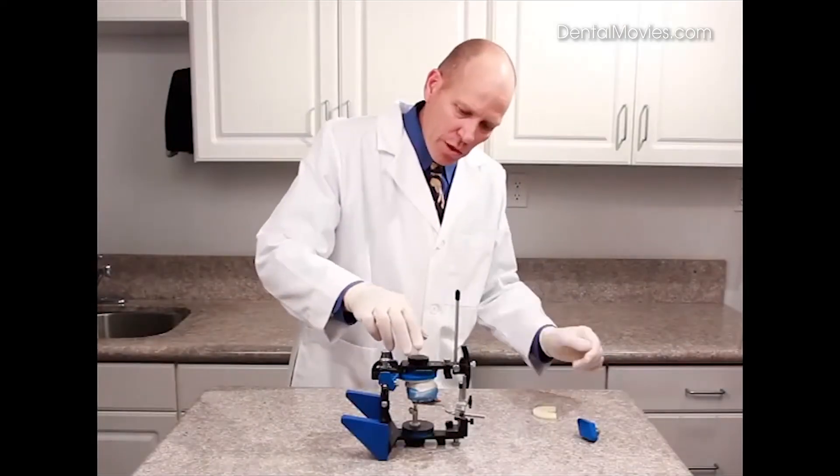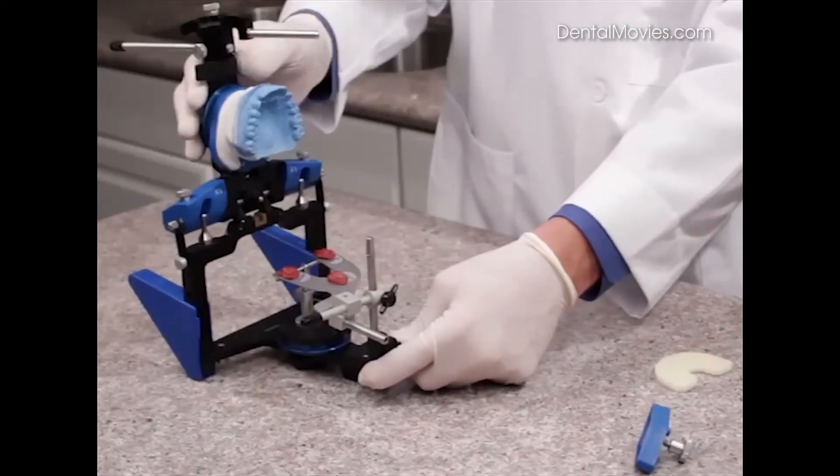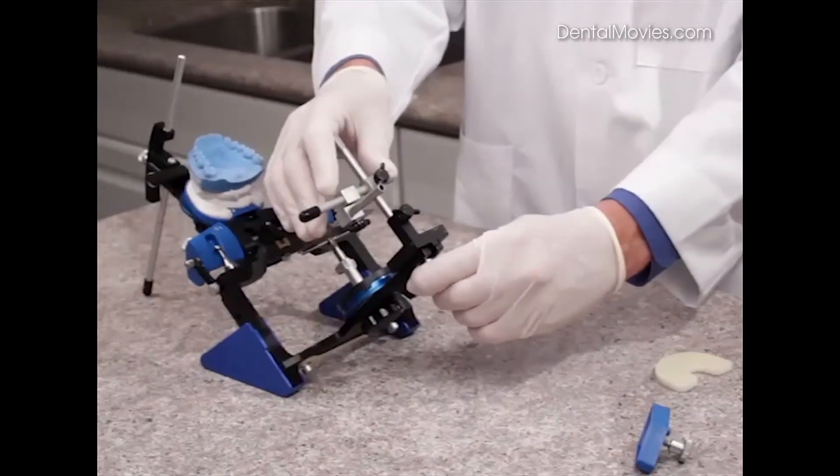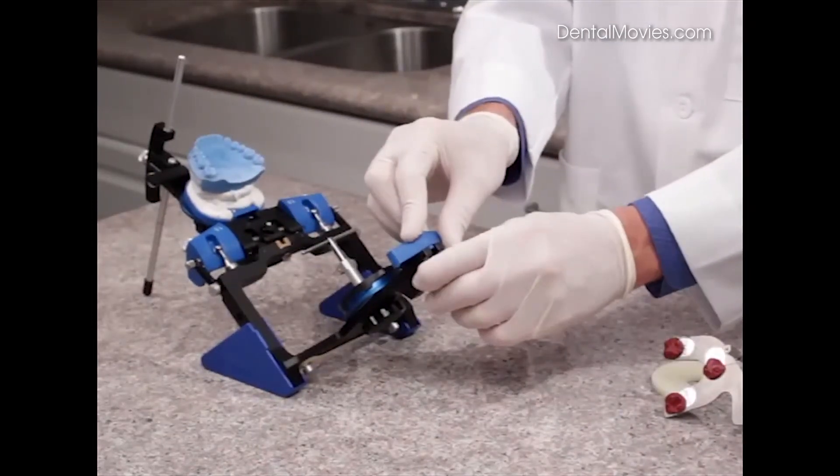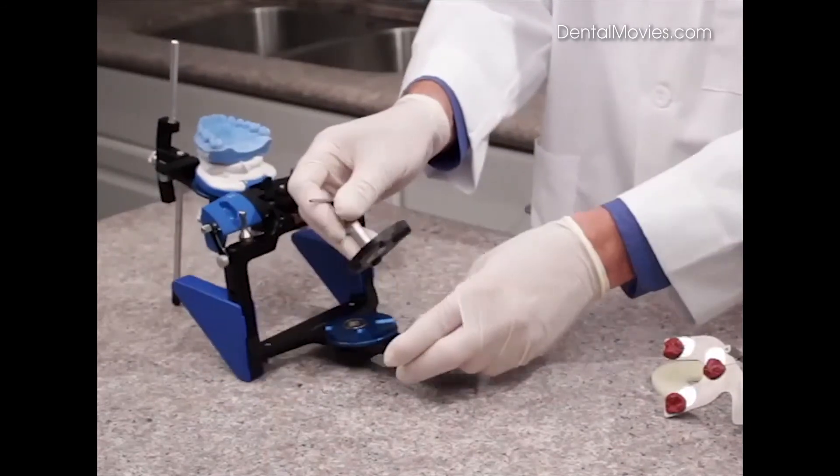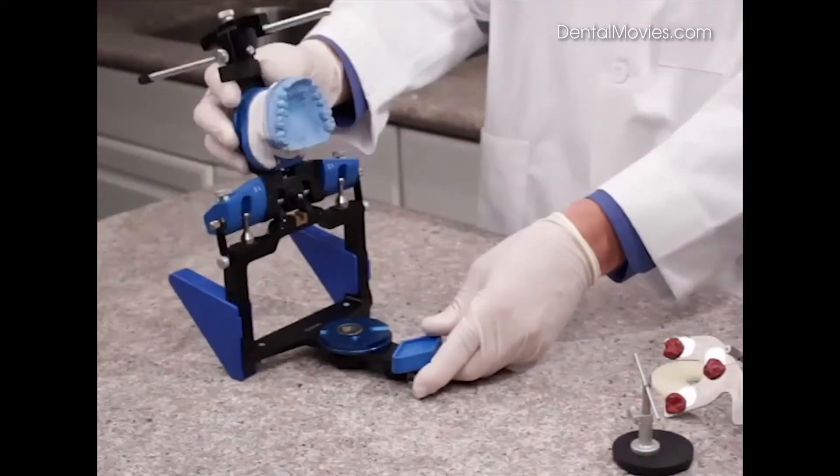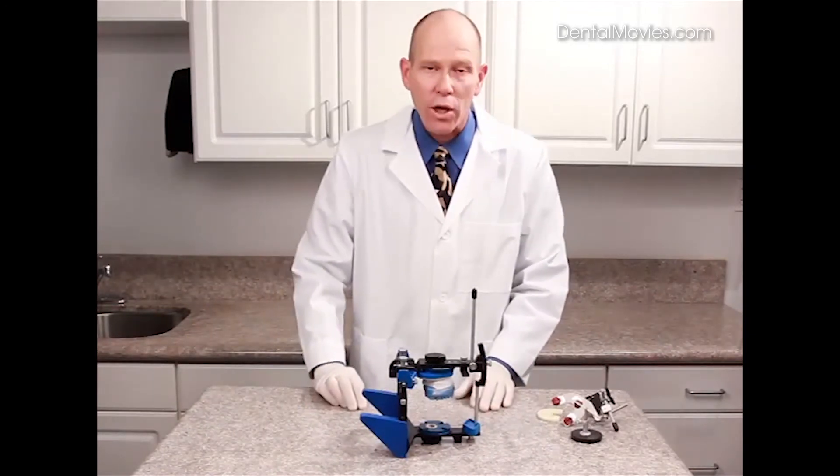The plaster is now set, so we can swing this open, and then we can remove the bifork assembly with the mounting fixture and replace the incisal table, and then remove the bifork support system. We can now prepare for mounting the lower cast at this time.